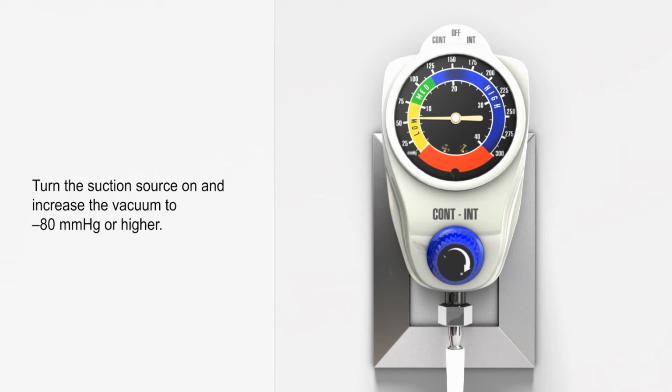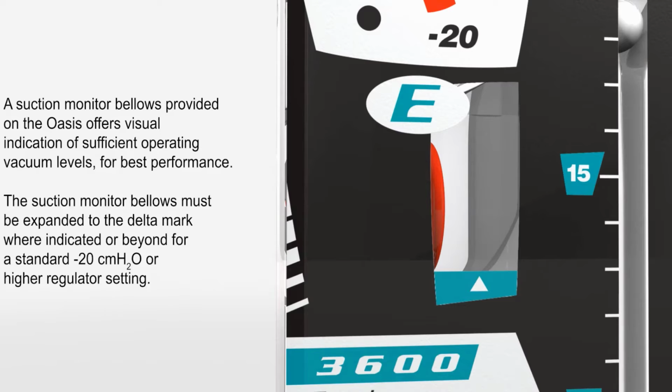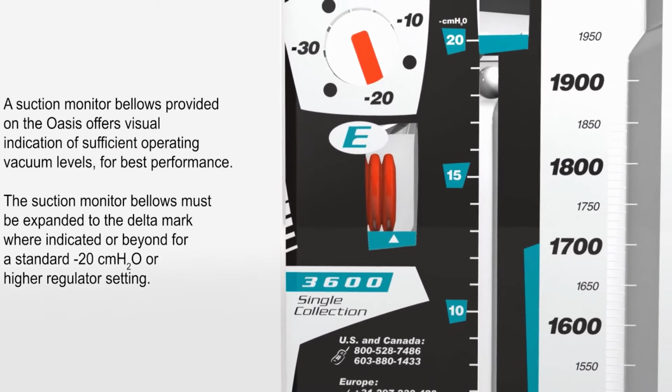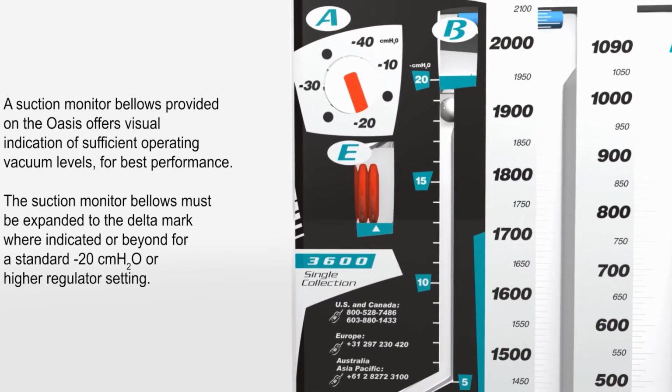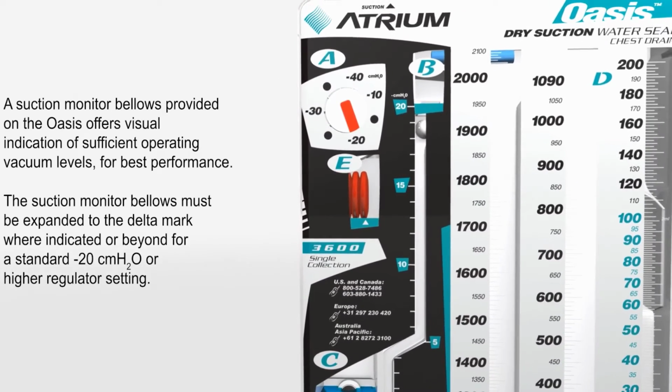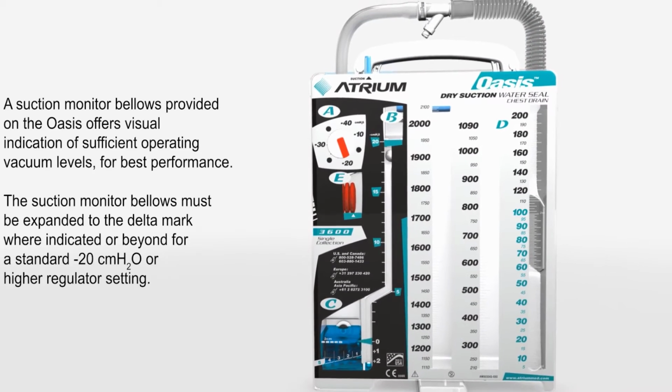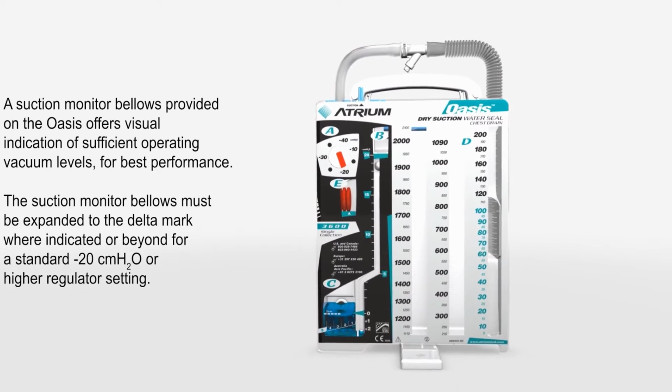Turn the suction source on and increase the vacuum to -80 millimeters of mercury or higher. A suction monitor bellows provided on the Oasis offers visual indication of sufficient operating vacuum levels for best performance. The suction monitor bellows must be expanded to the delta mark where indicated or beyond for a standard -20 centimeters of water or higher regulator setting.